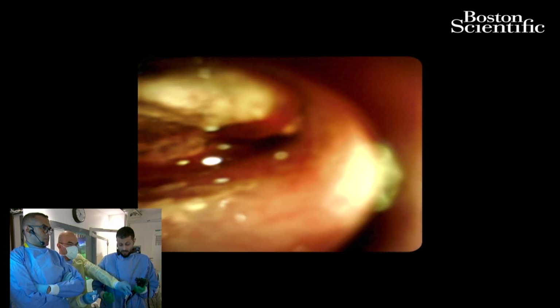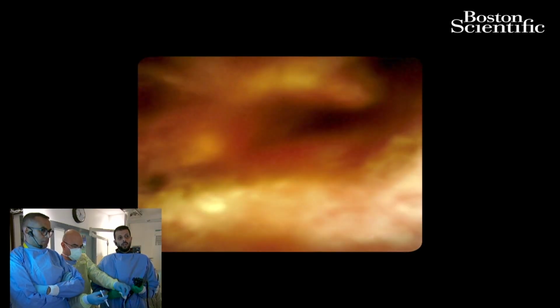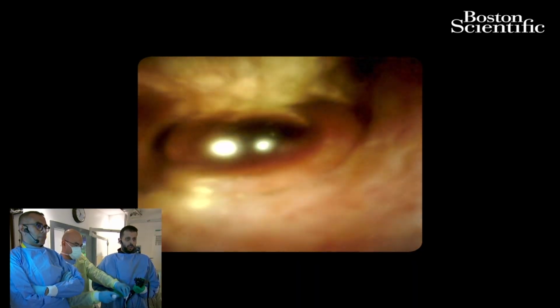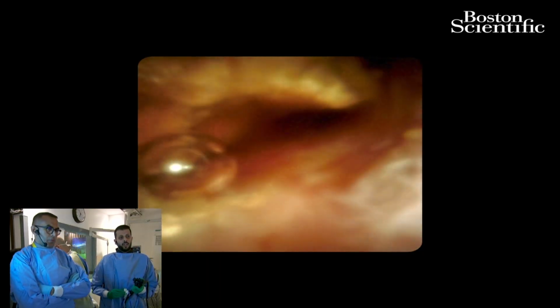In addition, he's in his late 50s. Yes, he's in his late 50s, and the cholecystectomy was a long time ago. So I don't want to fall into the trap of premature closure and just brush it off by saying it's probably post-cholecystectomy, which it definitely can be. But I just want to do my due diligence since I'm here in the duct and just take a biopsy.